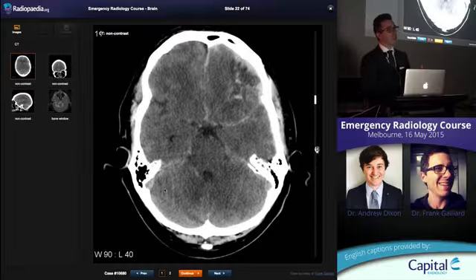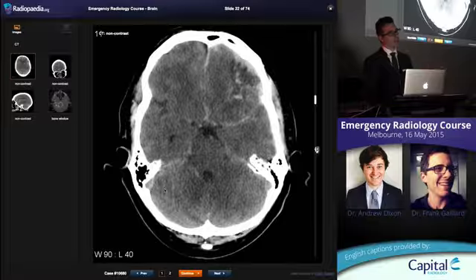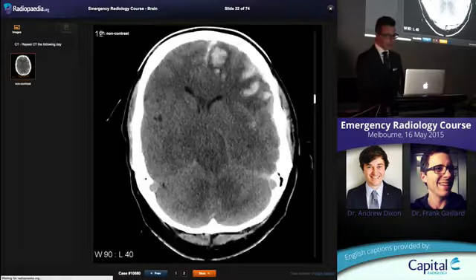Again, with the advent of CTA, the threshold for looking has been reduced, because you used to have to put a needle initially directly into the carotid, for any of you that have seen the original Exorcist, or more recently through the femoral artery, which carries a stroke risk itself and complication risk. With the CTA, you only really have the contrast and the radiation dose to worry about, and it's a small price to pay if you are uncertain.